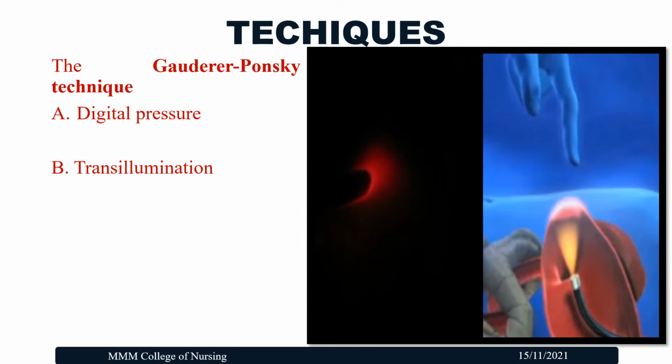which can be seen indenting the anterior gastric wall by the endoscopist. The second step is transillumination, otherwise referred to as diaphanoscopy. The light emitted from the endoscope within the stomach can be seen through the abdominal wall.